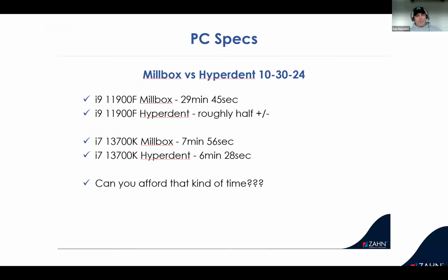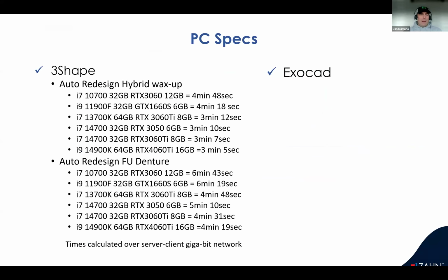Well, here's, I jumped ahead of myself. Here was the slide I showed in October about a simple computer upgrade, and can you really afford that much time loss in your day? And here were some times that we just did. We just upgraded our computers in the lab, and we started getting a little in depth with this, and taking this a little bit further than it was probably needed.